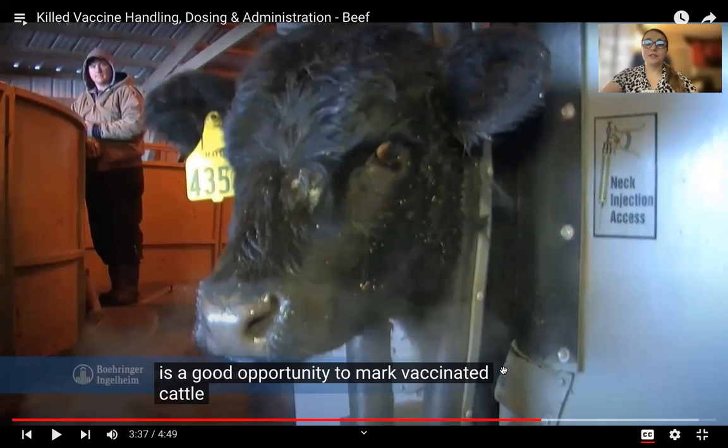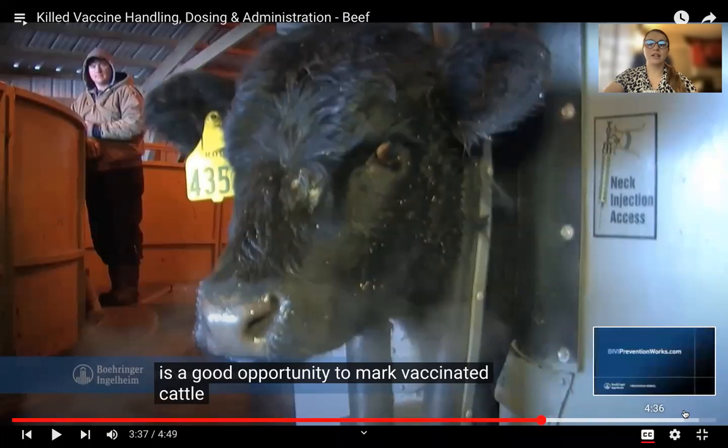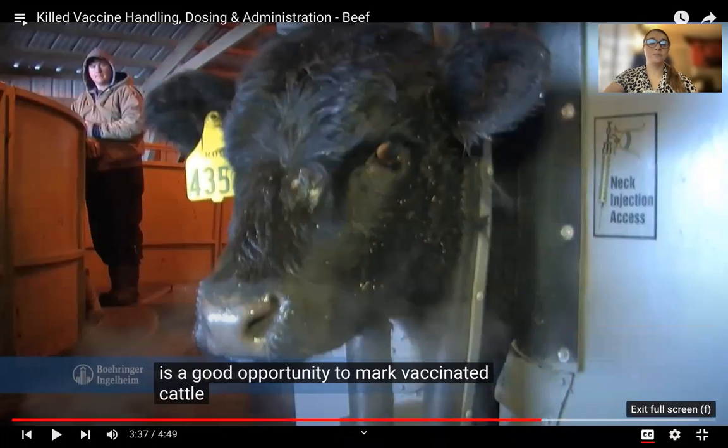And they'll use that dosing syringe for the whole rest of their herd. They're going to keep using that. So this is just him washing it out and all of that. It's not going to be a syringe like with our small animals, where we'll just throw it away after a use. With this syringe, they'll actually be cleaning it out and reusing it.